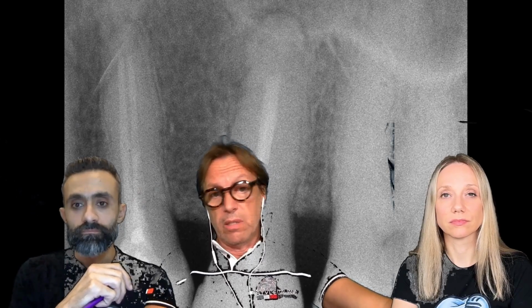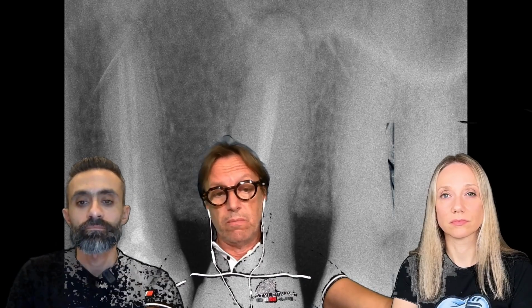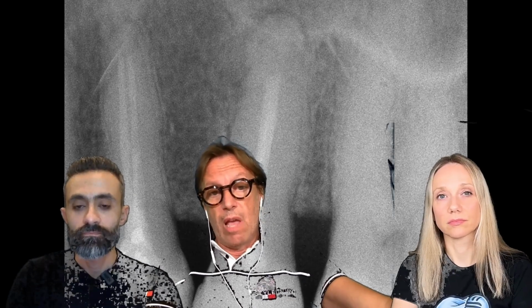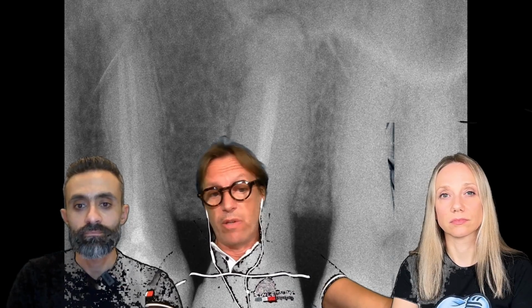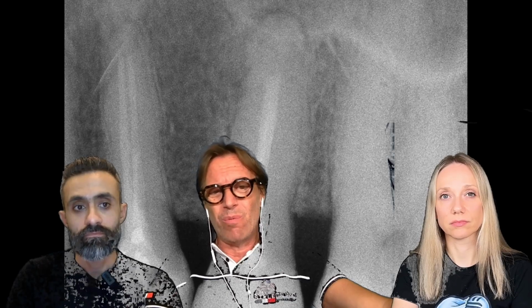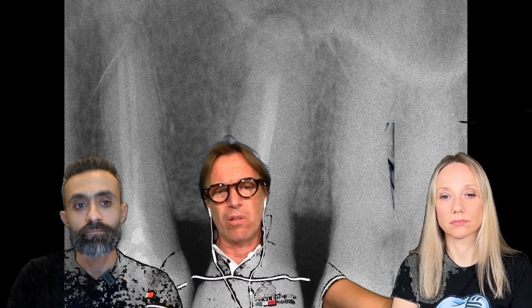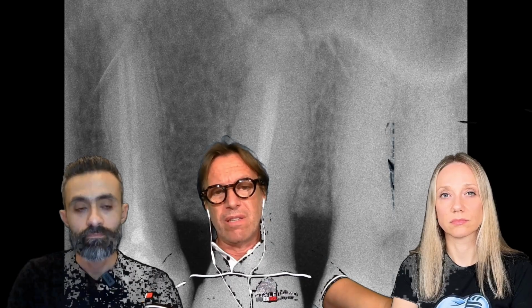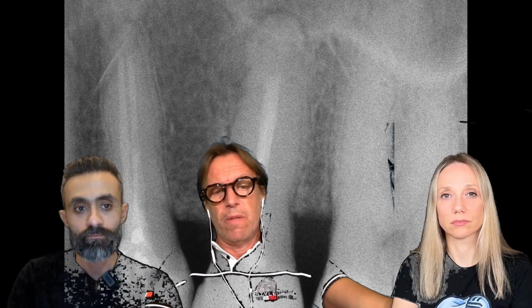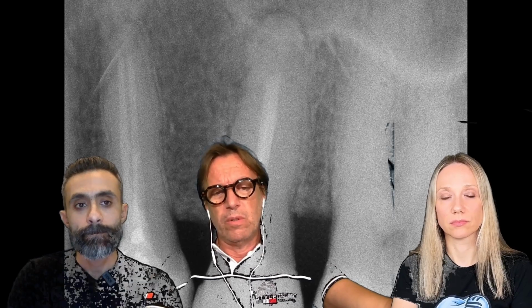The other thing that is very important is to understand where the lesion is, only in the apical area or also laterally. Like in this case, the previous treatment is not so good, but in general, the patient got a crown recently, so she doesn't want to remove the crown.